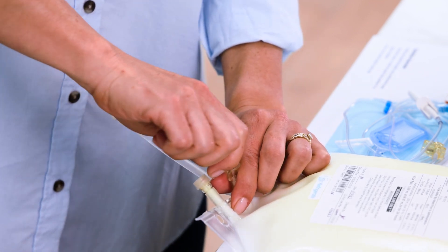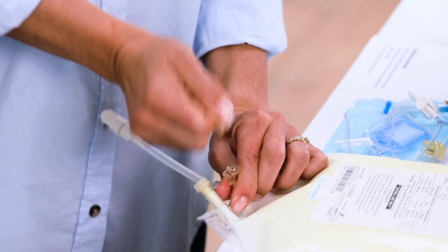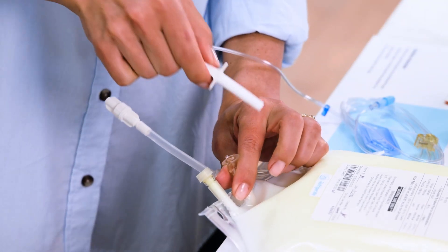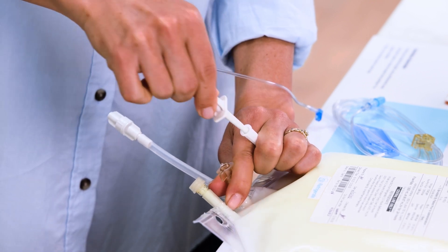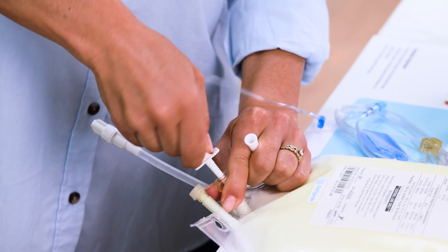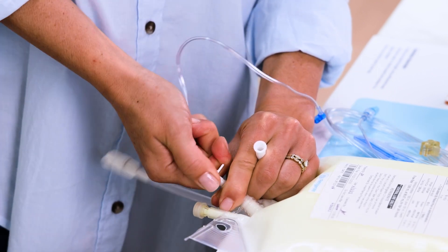Twist the cap off the spike port of the TPN bag. If your TPN bag does not already come with the IV tubing pre-attached, remove the cap from the spike end of the tubing. Insert the spike tip into the center port of the TPN bag using a pushing and twisting motion until you reach the stop. Be careful not to touch the spike tip or the spike port, as this can cause infection.